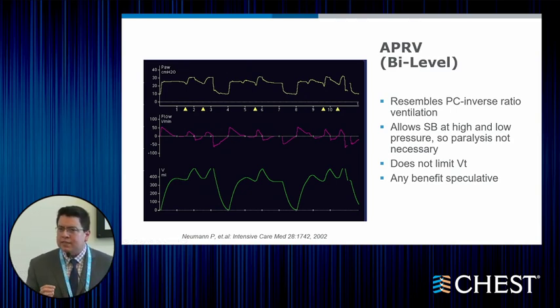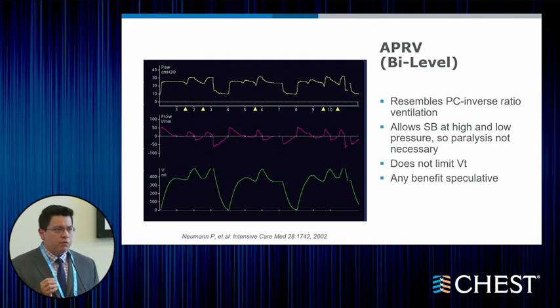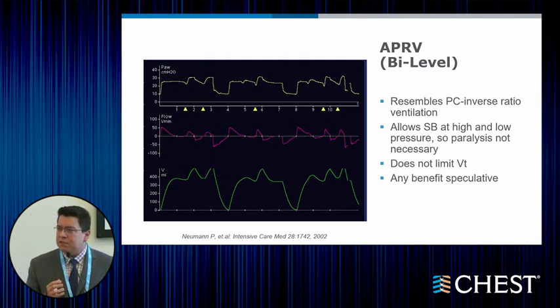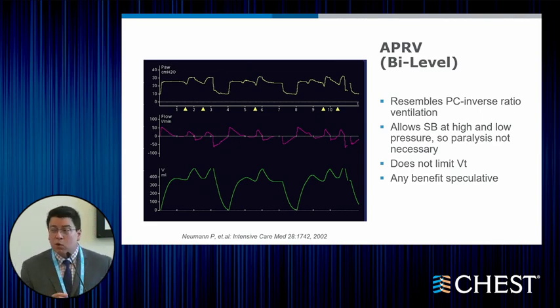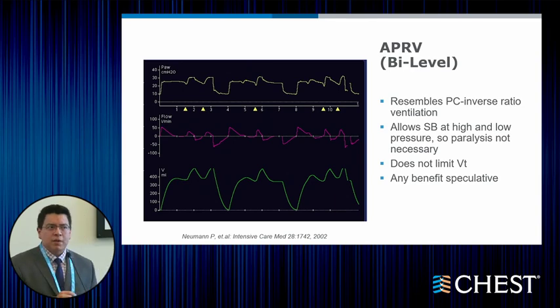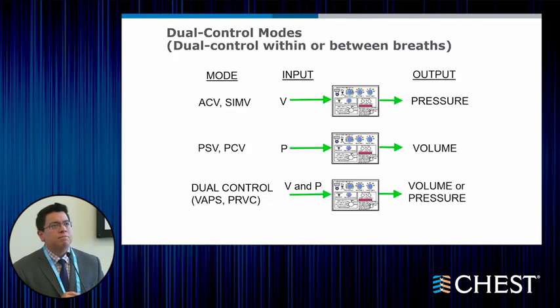The issue here is that it allows for a spontaneous effort, so we lose control of the tidal volume. And really, evidence-based medicine doesn't support any specific mortality or outcome benefit over any other mode of ventilation. So any potential benefit at this time is speculative.